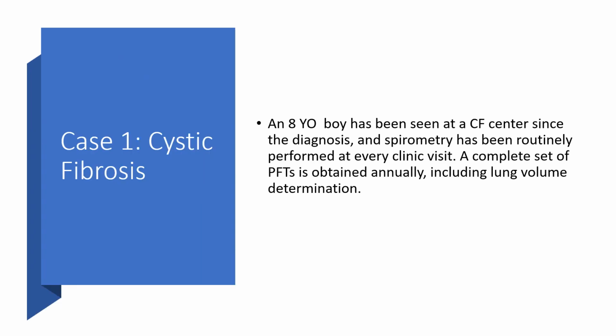So now let's take a look at the first of two cases that I've included in this presentation to try to illustrate a few of the points and just overall illustrate some of the common indications and trials and tribulations and interpretation involved in pediatric pulmonary function testing. The first, as you can see here, is a cystic fibrosis patient. He's an 8-year-old boy seen by the CF, or Cystic Fibrosis, Center since his diagnosis.